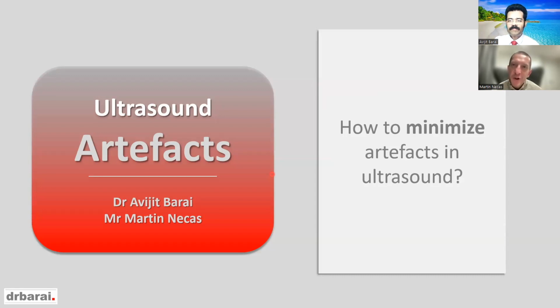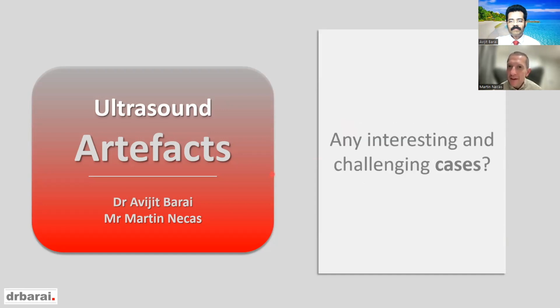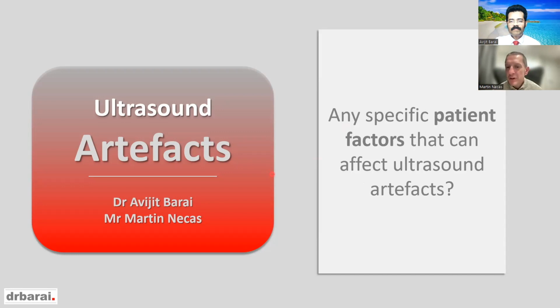So I think it's useful to know which artifacts will help, like shadowing with stones, and which artifacts really are a nuisance and need to be eliminated, such as reverberation, and how to do it. So absolutely, I think you really see the quality of the ultrasound images being very different in operators who are mindful of artifacts and mindful of the good use of acoustic windows versus those that don't really pay that much attention. And I think you can then get much better quality diagnostic information out of the patient. In fact, one of the criteria we use, for example, when we assess clinicians in their ultrasound images when they're submitting it for certification and so on, is whether they have managed to achieve artifact-free images.